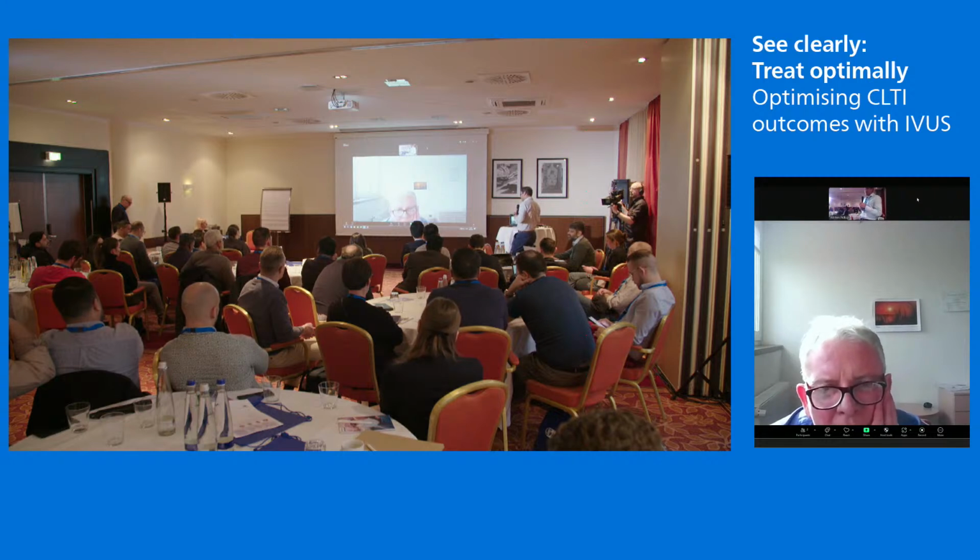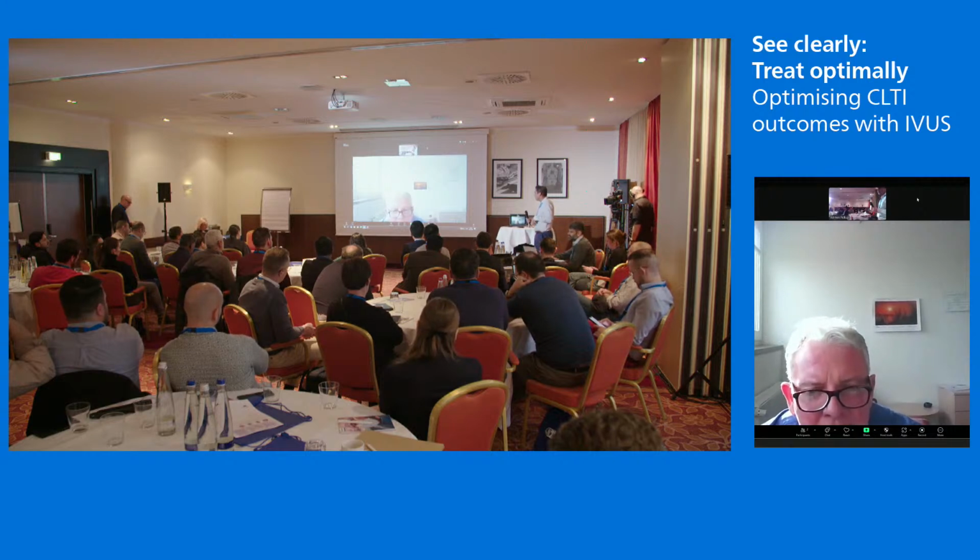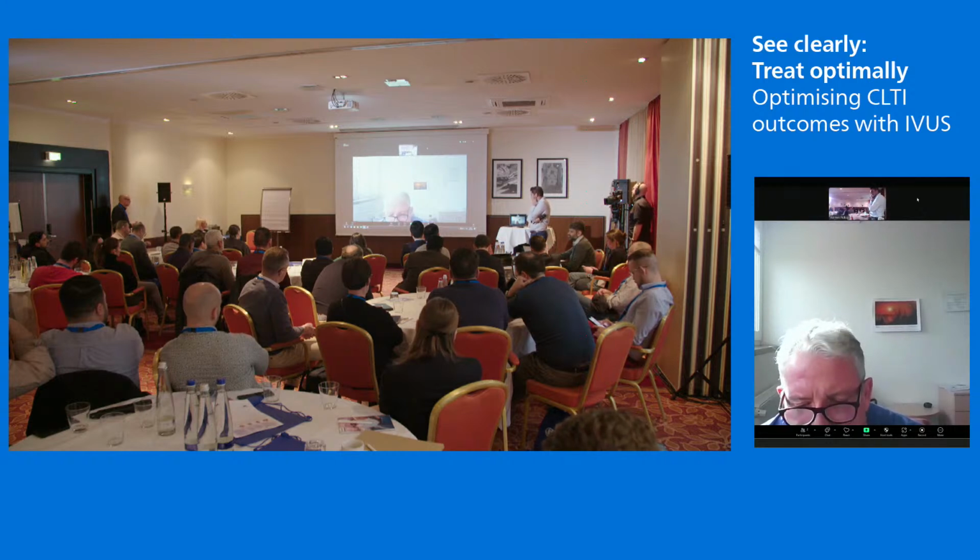Yeah, that's off-label, I presume. So if you want to be careful and you are a bit insecure, you use the 0.9 laser, which is the smallest one. I think Jos van den Berg from Lugano has done quite a few cases with a step-by-step technique.